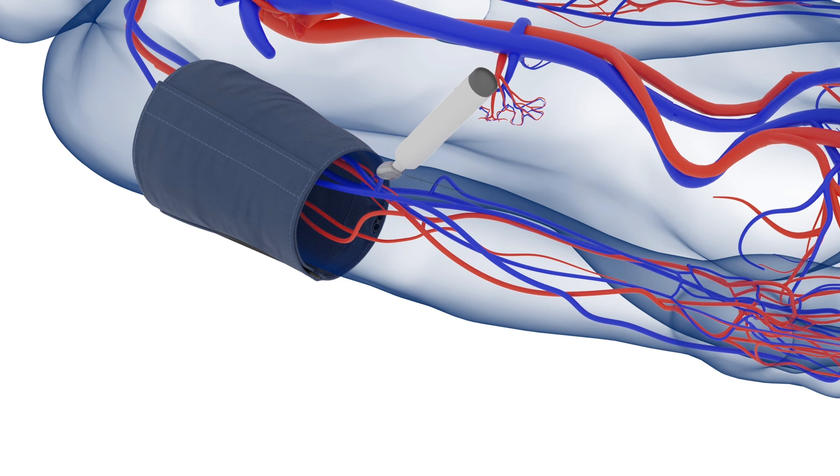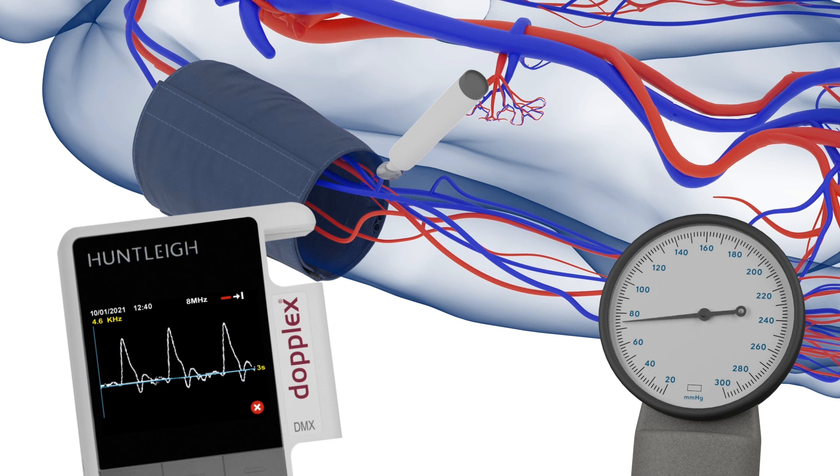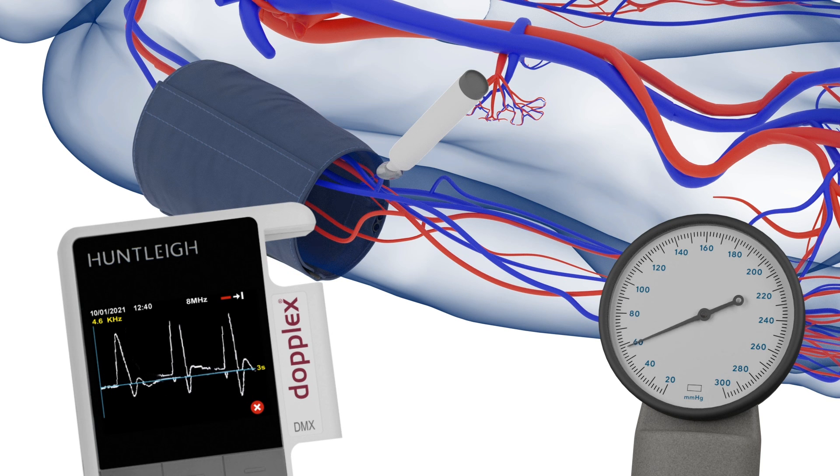Using the Doppler, locate the artery and hold the probe about 45 degrees to the skin. Inflate the cuff until the sound disappears, and then slowly deflate at around 3 millimetres of mercury per second. The point at which the sound returns is the brachial systolic pressure, which is then recorded.